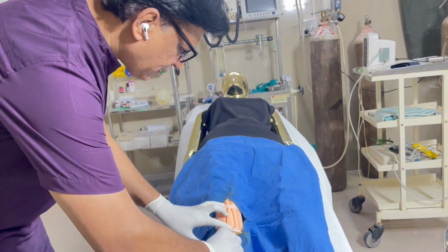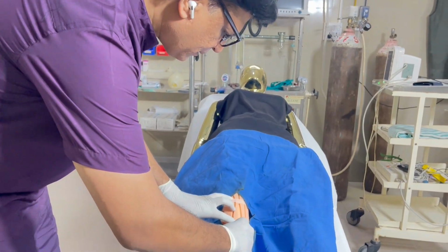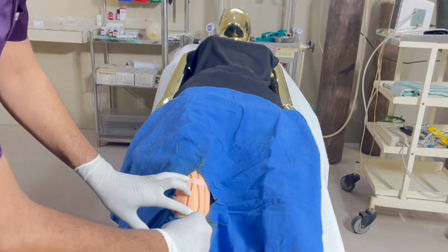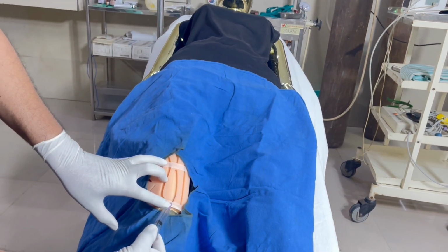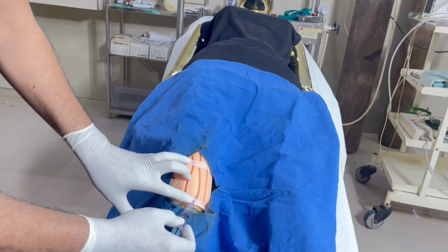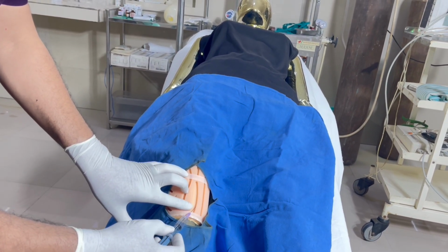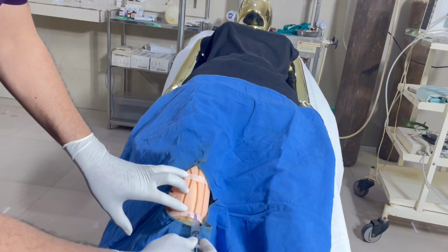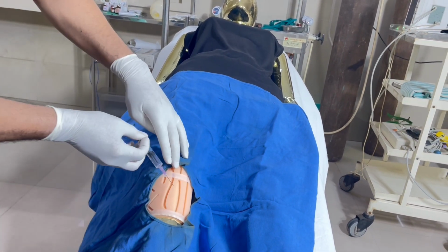Just so once I try to put the local inside, then I just withdraw the syringe out, check whether the blood is coming out. If it's no, then I will inject on this side, then on this other side, on both the sides.